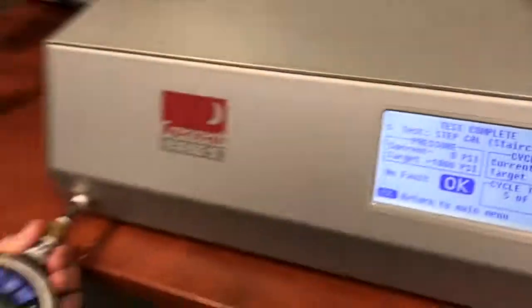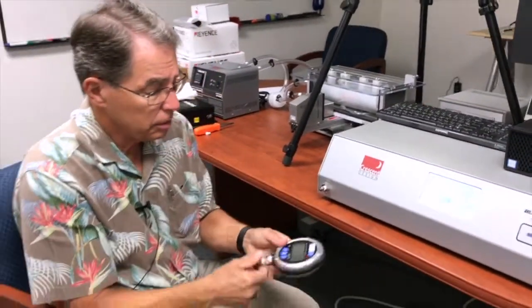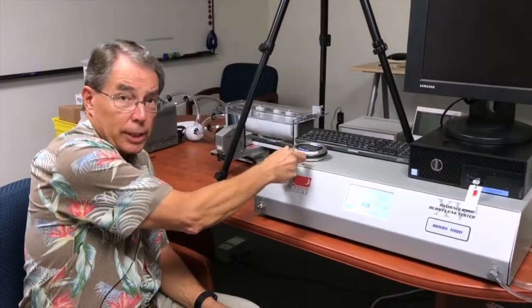So you have seen how to set up your machine for calibration and how to actually perform the calibration — you can see it's very simple. We've also created a staircase test to challenge it when you're done, so that you're confident that it's within tolerance. That's how easy it is. Thank you.